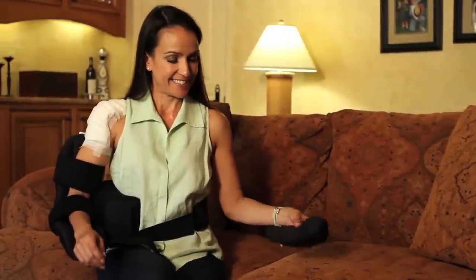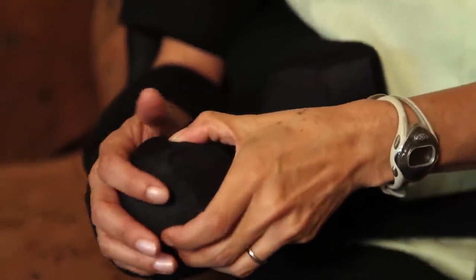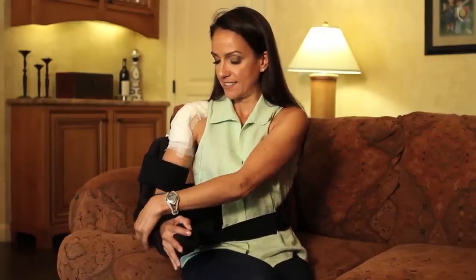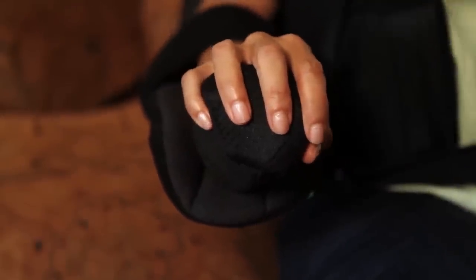The wrist bolster can be used to provide additional support for the hand and wrist. It is placed into the cradle alongside the hand, and the wrist strap closed over it. Alternatively, it may be placed directly under the wrist if more support for the hand is needed, again secured by the wrist strap.